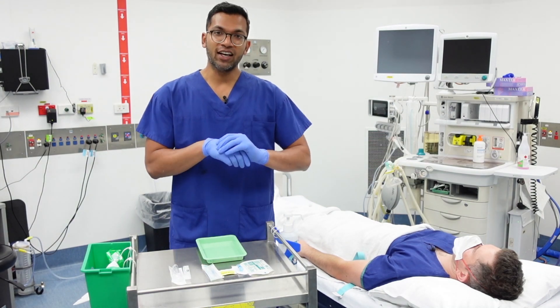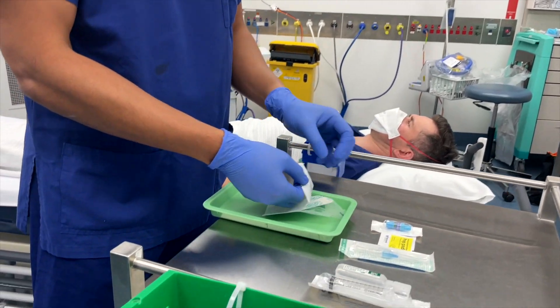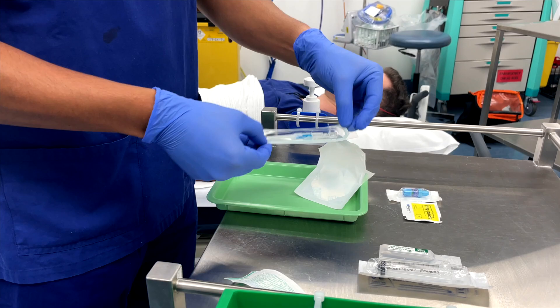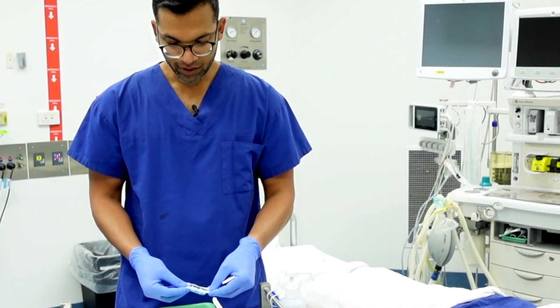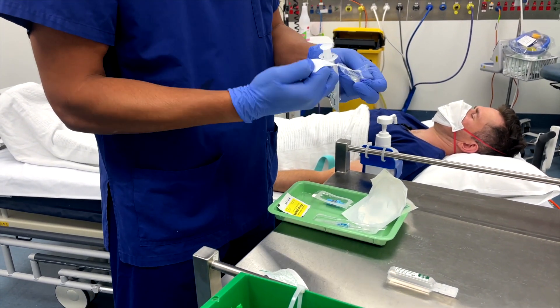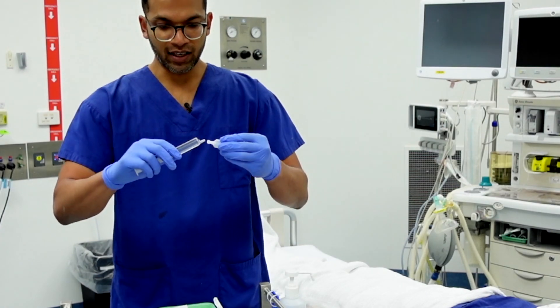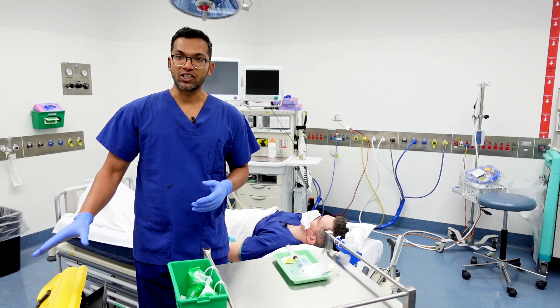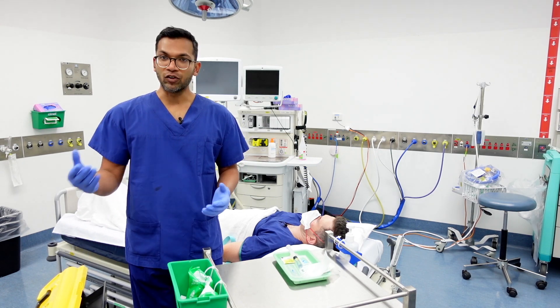When doing my setup, I first make sure I've done hand hygiene and put on non-sterile gloves. I open each item without necessarily taking it out of its cover — I can open the Tegaderm, open the cannula keeping it in its plastic wrapper, and the IV bung I can hold at the last minute keeping it clean with a microsterile feel. I draw up 10 mls of saline and keep it capped so it's not in contact with the outside world. The most important thing in my setup is having a sharps bin close by, so as soon as cannulation is done I place the sharp straight in the bin to minimize injury risk.